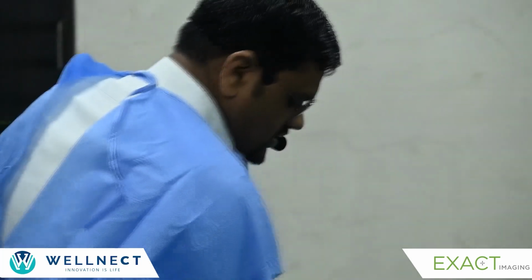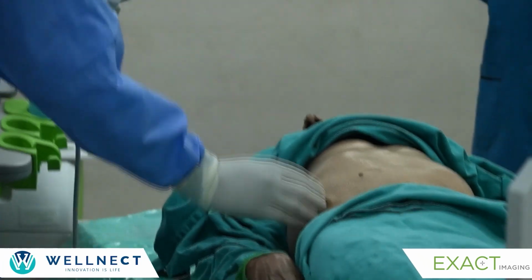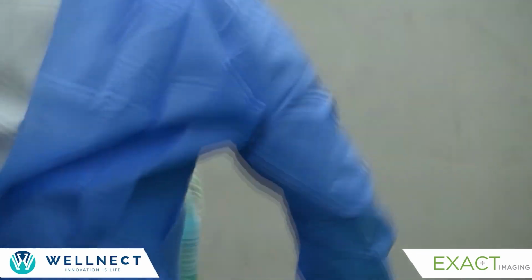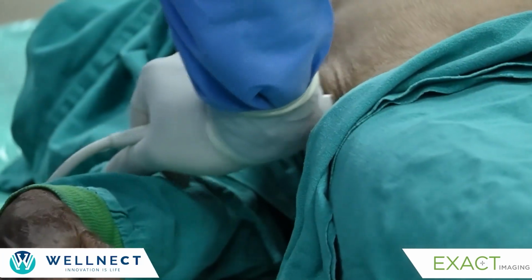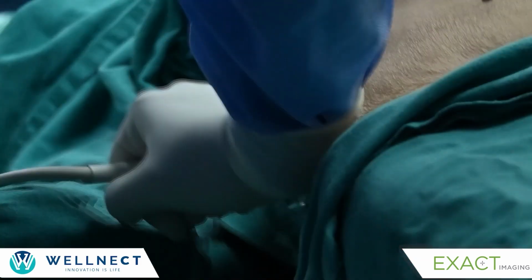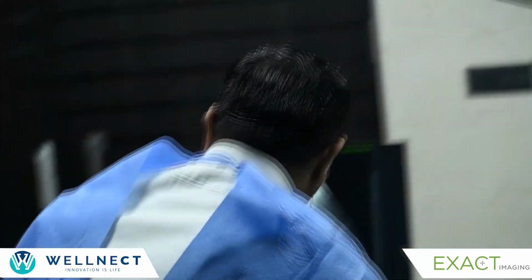Now the first thing that I have to do is this is the rib cage, this is the kidney. The kidney would be half in the rib cage and half below the rib cage, and it is 30 degrees posterior. So I hold my probe like this, and I would place my probe 30 degrees tilted. That is how I will see the kidney. The first thing that you see is your liver, and then you see this kidney picture. So this is the kidney.